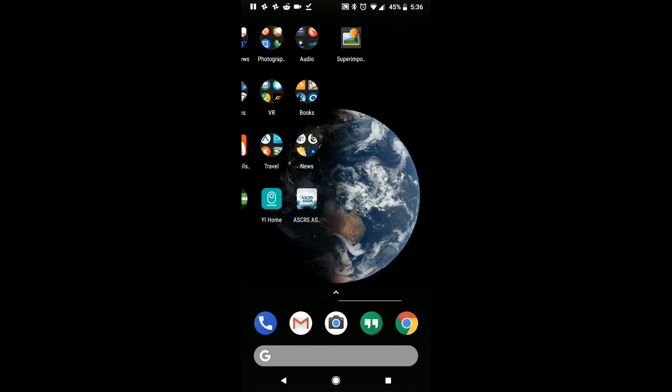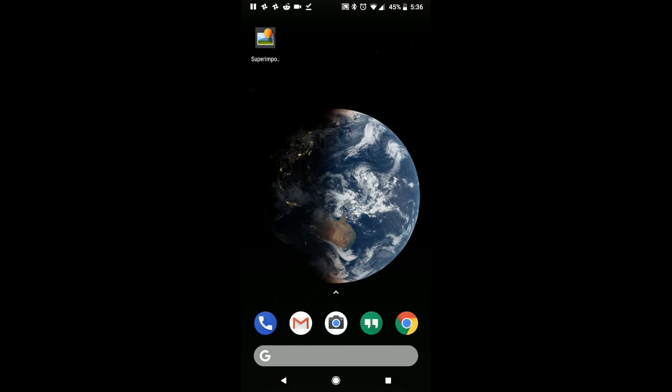So the first thing that we're going to launch is not Superimpose, but we're going to launch the camera app, whatever app it is that your phone has. This is mine.